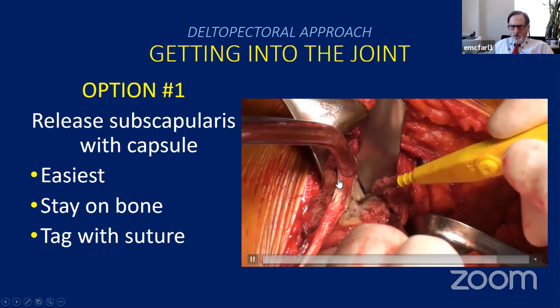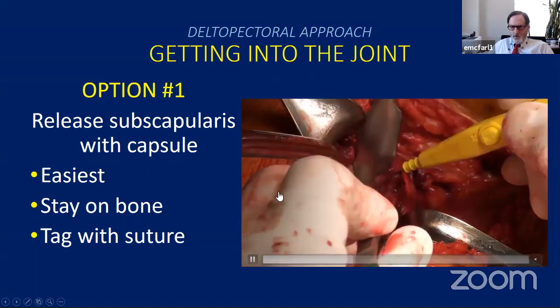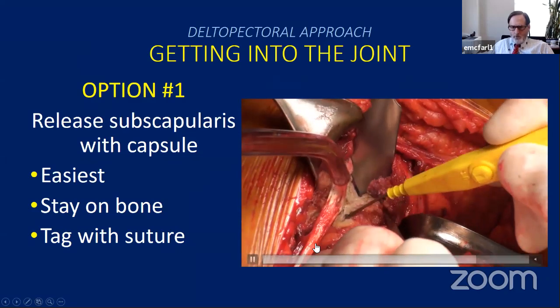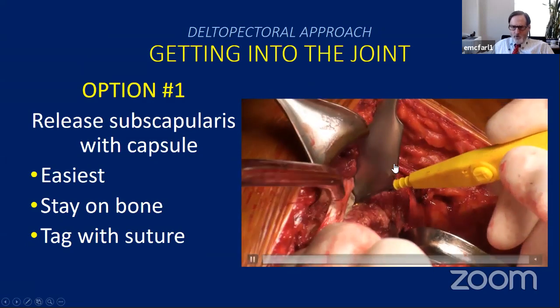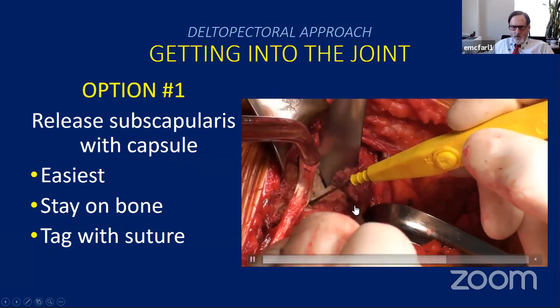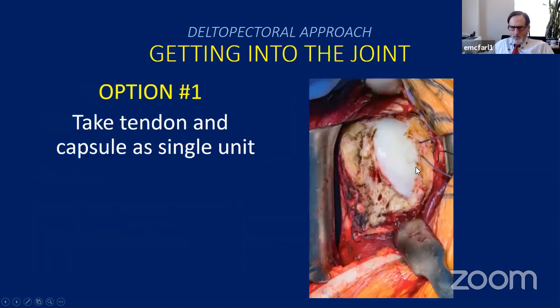And so you can just peel the subscap right off the lesser tuberosity, and you can start up higher and work your way down onto the head neck angle or shaft down here. And it's pretty straightforward. This retractor can also put tension on the subscap so that you can just gradually peel it off like this. The key though is to stay on bone. And then once we're done with that, I like to tag it with a suture so you can find it later, and if necessary, put it back. But this is what it sort of looks like.